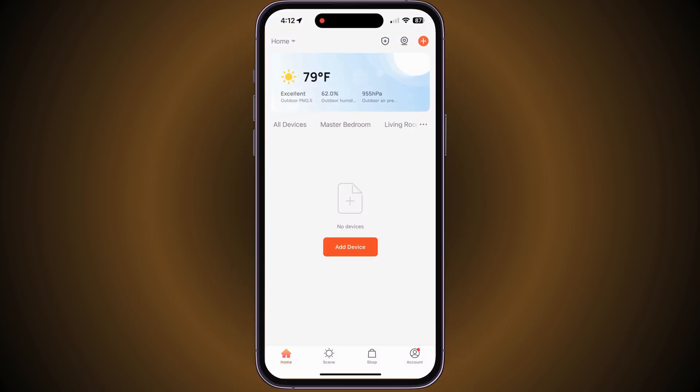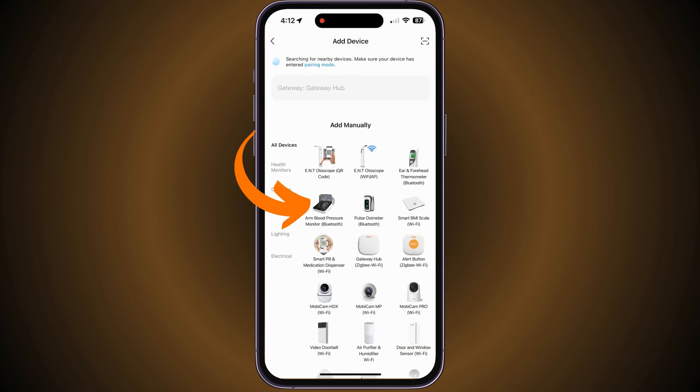On the main screen of the Mobi Smart app, tap on Add Device, then select the Arm Blood Pressure Monitor.